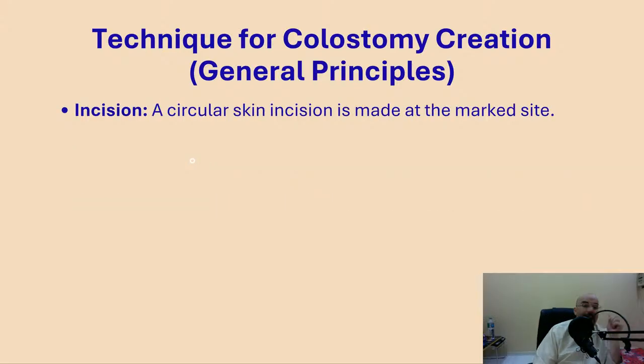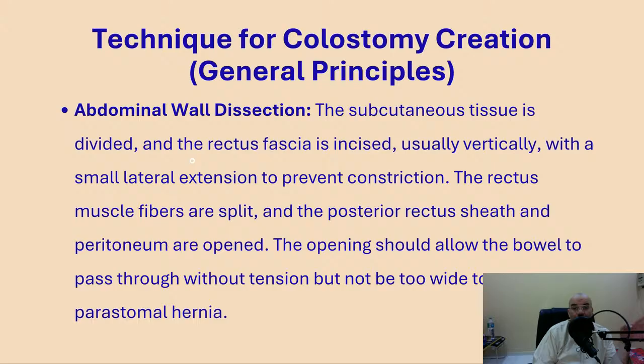Now, at the end, let's say that the stoma nurse has marked the site. From this marked site, the doctor will start the incision. And now, with robotic surgery and the laparoscope, they will enter the body from this site to search exactly where they will work to make the dissection.